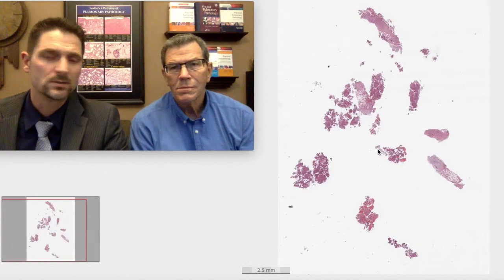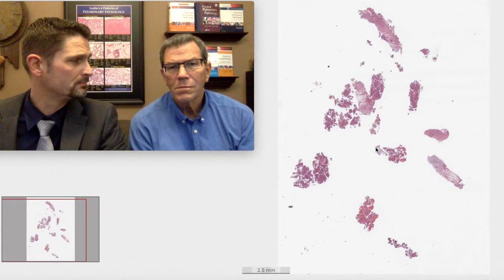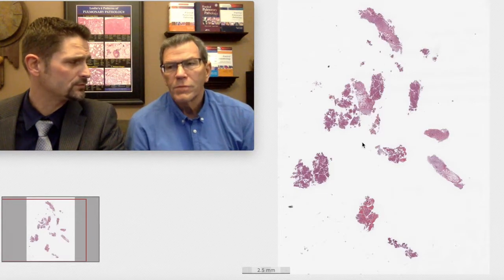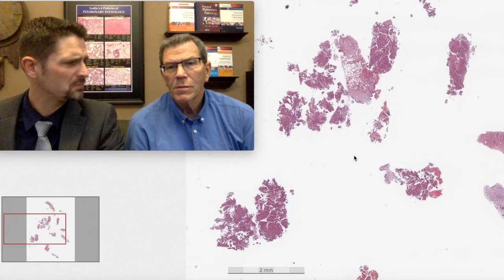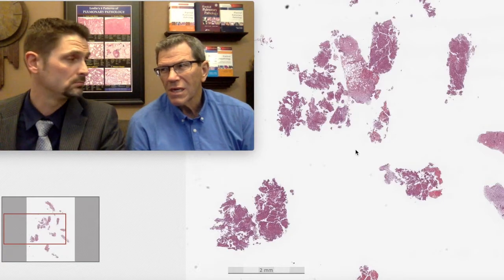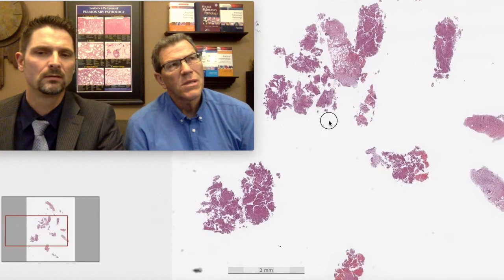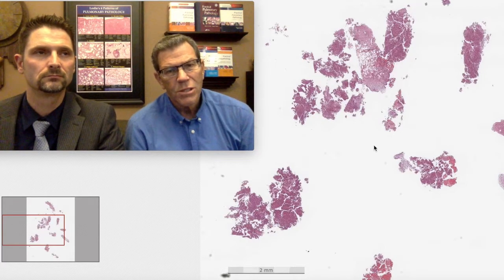So we've got a needle core biopsy here from an older male. 94-year-old male, and he presents with recurrent pleural effusions. I think he has some imaging studies, right? He has multiple pleural-based mass lesions, and unilateral, which is kind of a key thing. Unilateral pleural-based mass lesions, old male. So think about that for a second. Unilateral multiple nodular lesions, pleural-based. Okay, good.